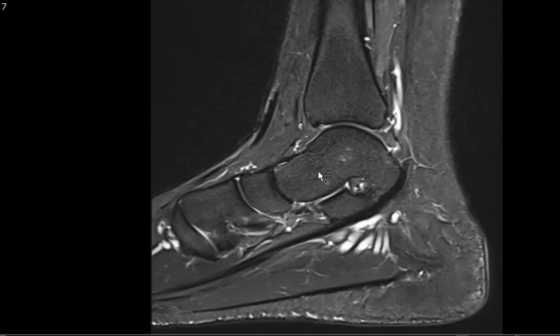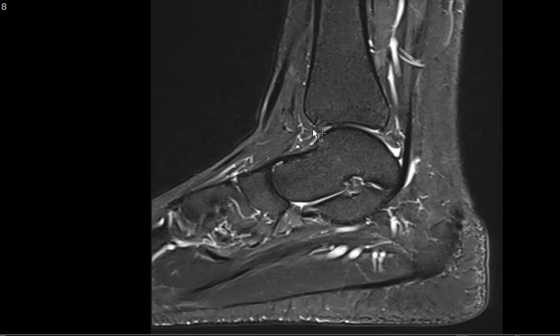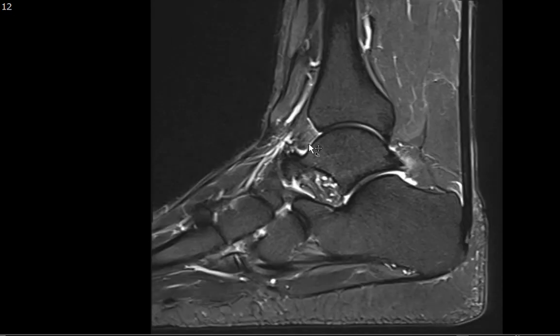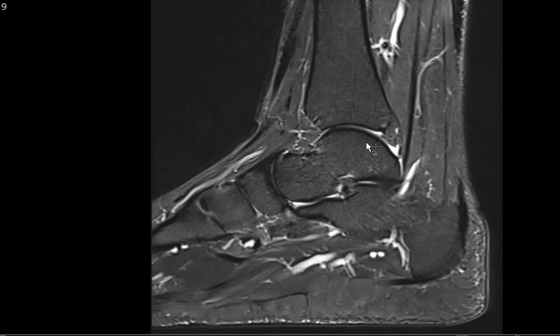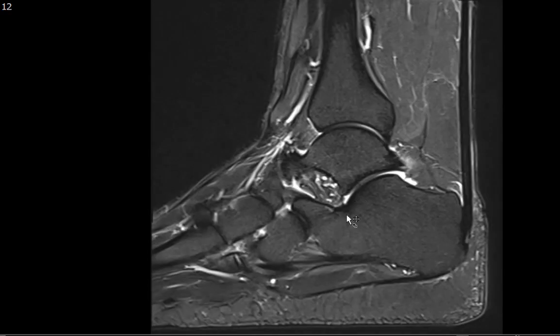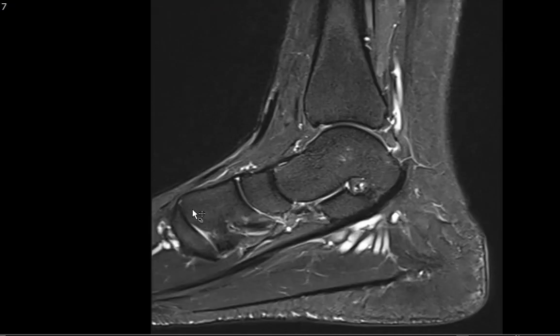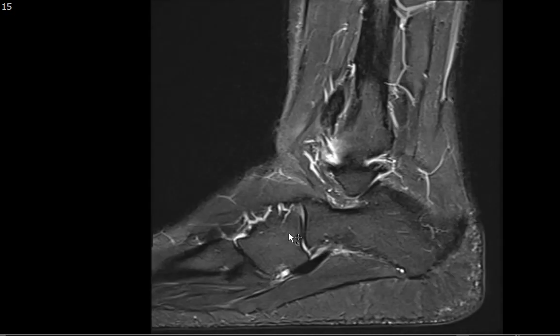Coming back to the sagittal T2 fat sat, you also want to look for a joint effusion at the tibiotalar joint. This is just physiologic fluid — nothing extending the joint. You can also look for a subtalar effusion, which we don't really see here, and effusions along all the different joints of the hindfoot, midfoot, and proximal forefoot.